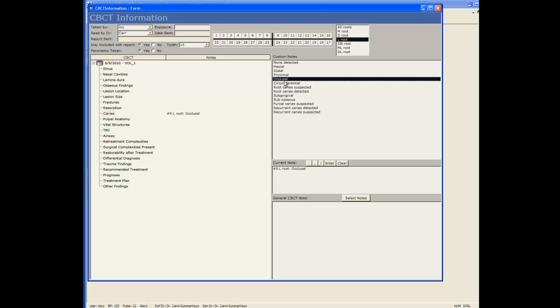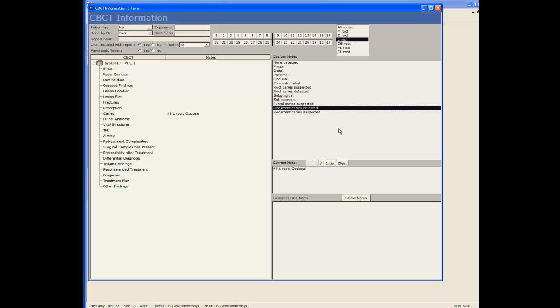You can change this list by right clicking and going to edit list. So you build your note by simply clicking items.